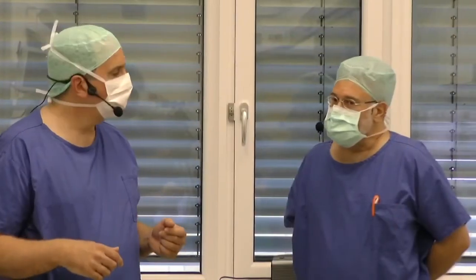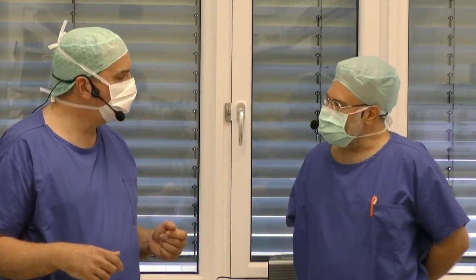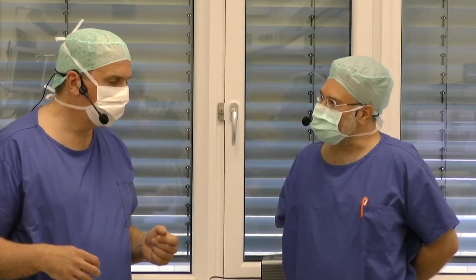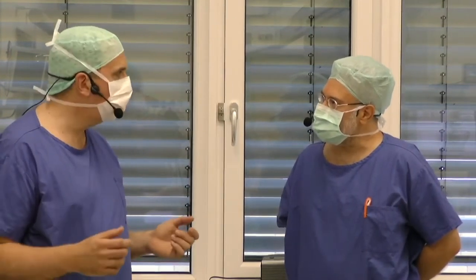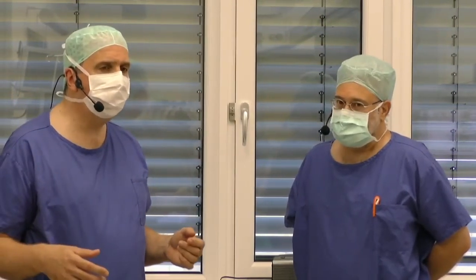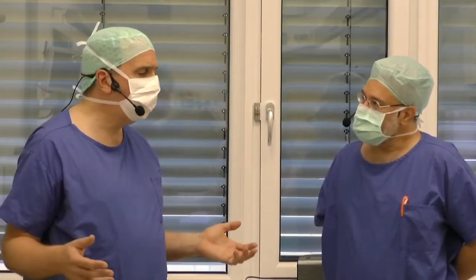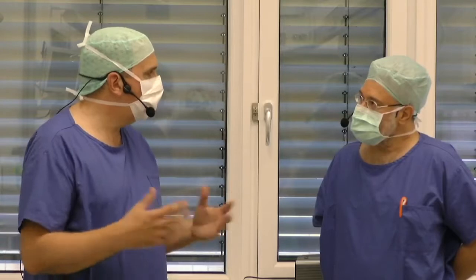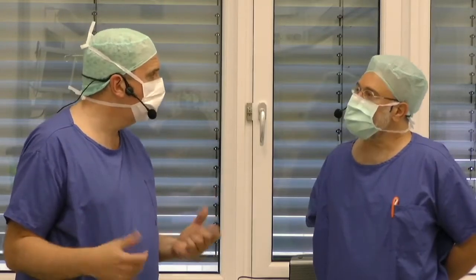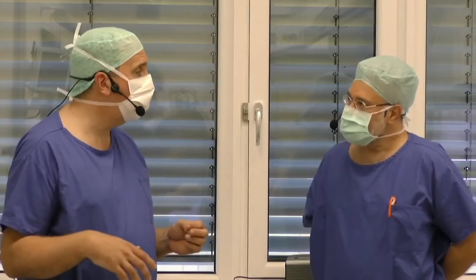Good. So I would think that if you're doing both eyes the same day, you're maximizing your wow effect, especially if you're using multifocal lenses. Absolutely. We had a patient in this morning also doing a Liberty system. The patient was +8 with a corneal astigmatism of -4, and this was an absolute wow effect. The patient can walk outside this clinic without glasses and can see. Yeah, it's a certain wow effect. Absolutely.